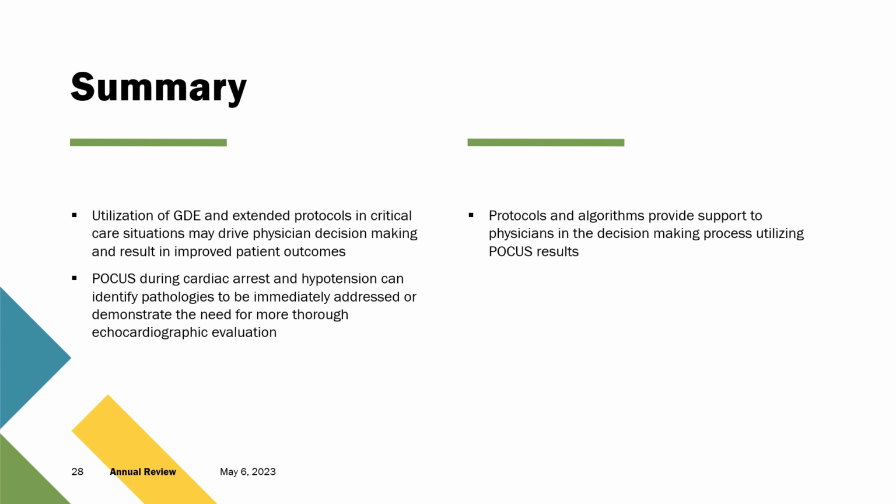Point-of-care ultrasound during cardiac arrest and hypotension can identify pathologies to be immediately addressed and demonstrate the need for even more thorough echocardiographic examination once that patient is stable. And the protocols and algorithms provided can support a physician in the decision-making process utilizing point-of-care ultrasound results.